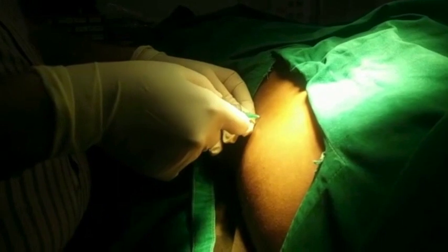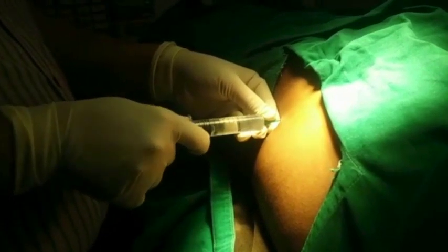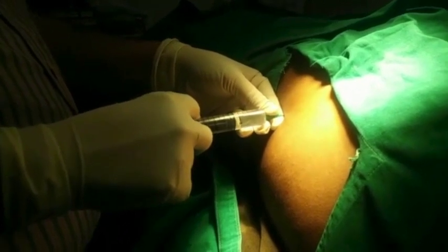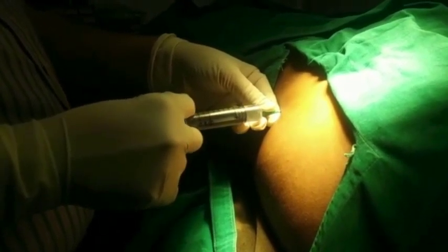This is the first pop and bounce, and this is the second bounce and pop of the internal oblique fascia. After aspiration, I am injecting 20 ml of 0.25% ropivacaine. This is an LSCS patient, so I am injecting 20 ml of LA on both sides.